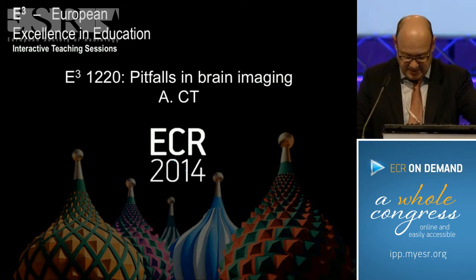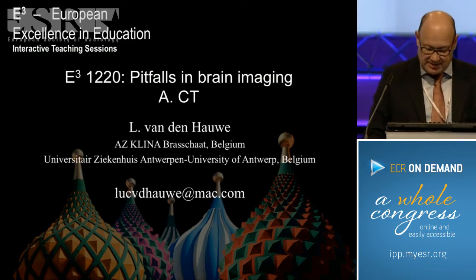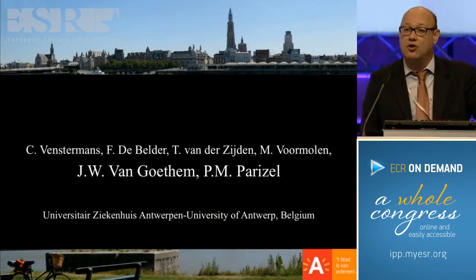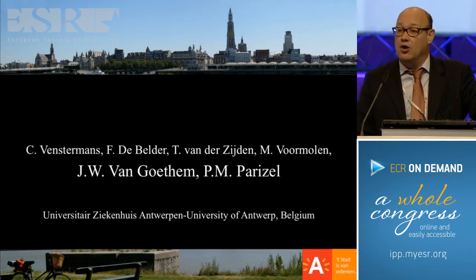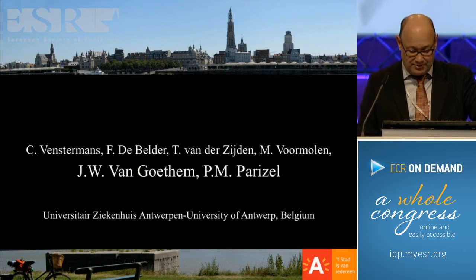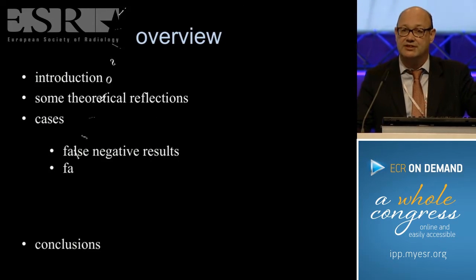Okay. So let's start pitfalls in brain imaging, CT. I first would like to give credits to my colleagues of the Antwerp University who share cases with me, because what I will show you is not only cases that I collected myself, but also my good friends collected and shared with me. After a short introduction, I will have some philosophical discussion with you and some theoretical reflections, and then, of course, we will come to the real cases.